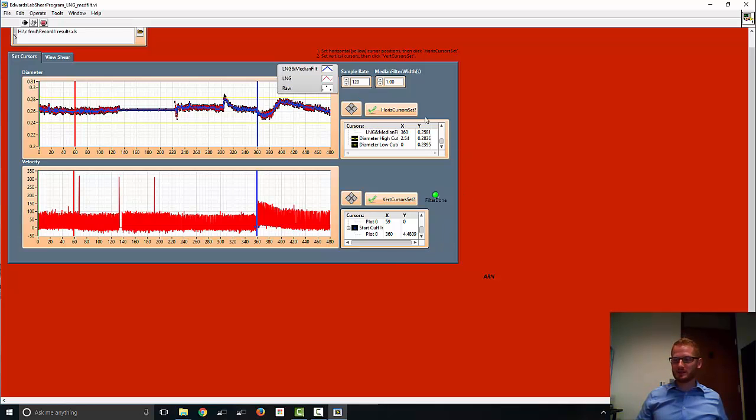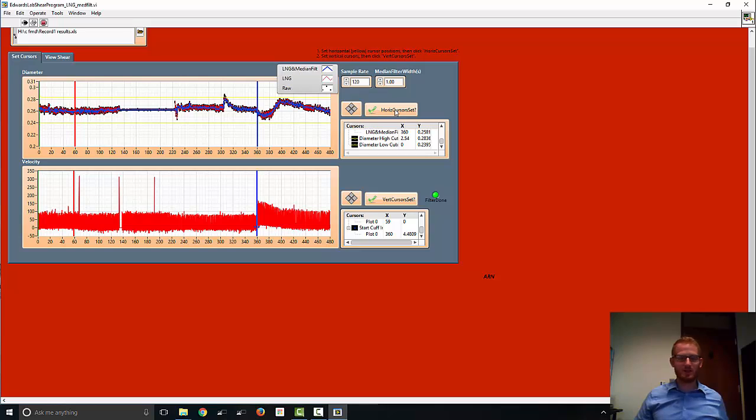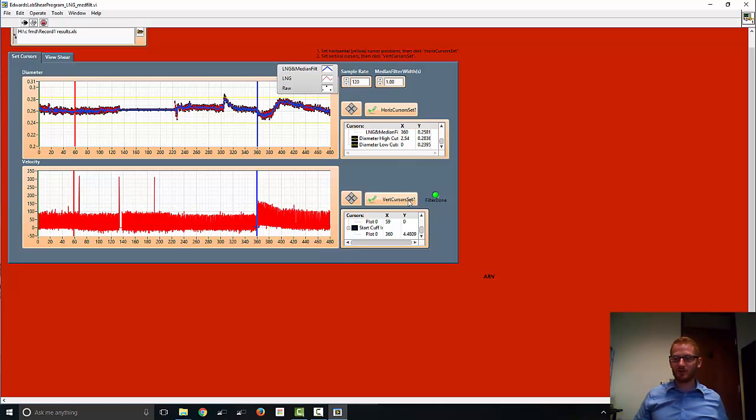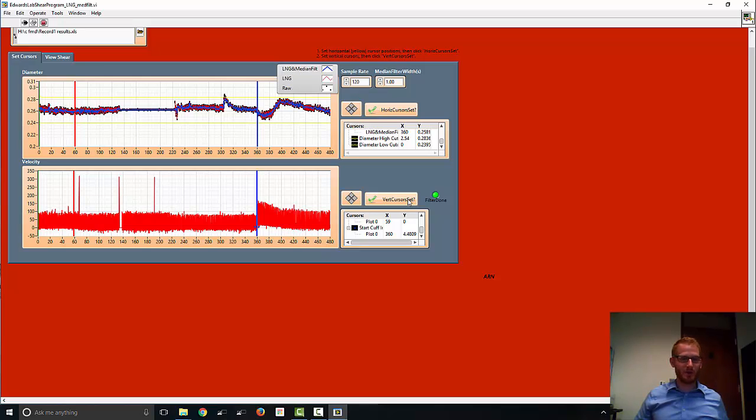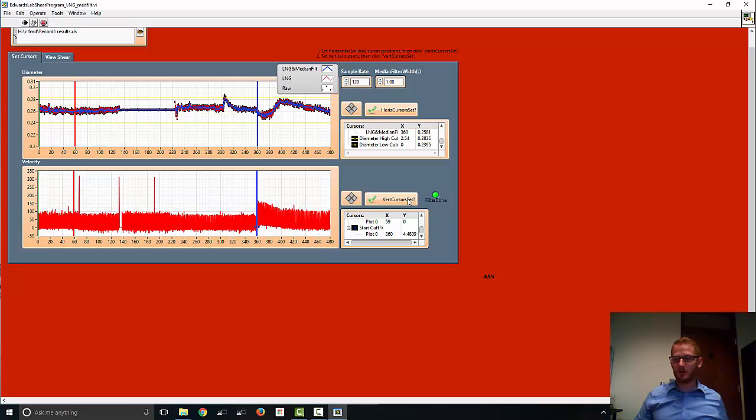Alright. So we already set our horizontal cursors with yellow ones and we hit the button so they're done. We can't move them anymore. Now we're about to hit the button for the vertical cursor lines, which means we won't be able to do anything with those anymore. They're set. But it is going to give us our answers to or values for flow mediated dilation and some of the secondary values.